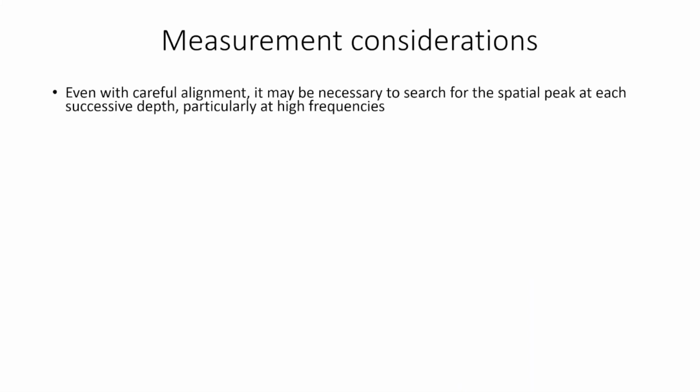So I hope that was a good overview of the calculations and the workflow. I wanted to highlight a few of the special considerations in this process. One is, even with careful alignment, it may be necessary to search at each depth to find the peak, and not just assume that you found the depth and walk straight down.